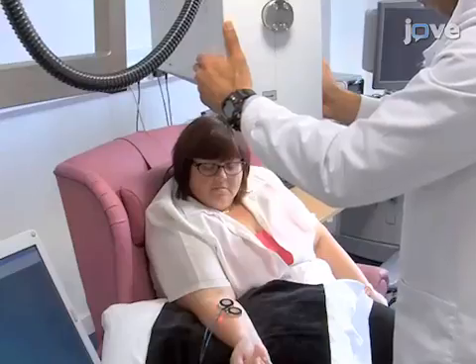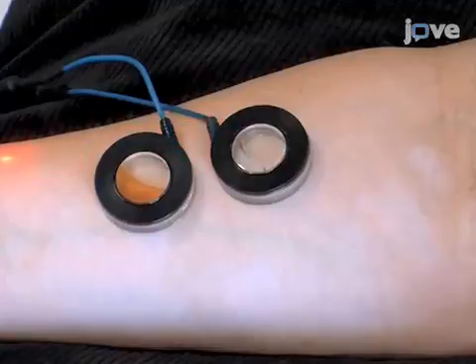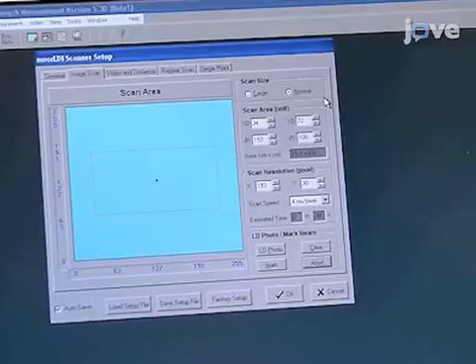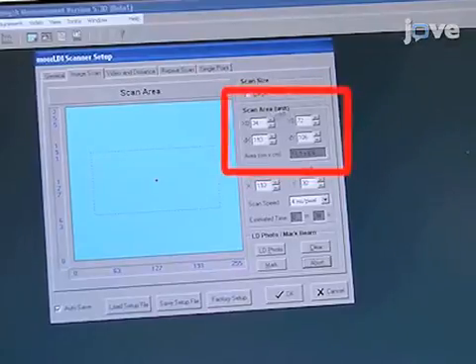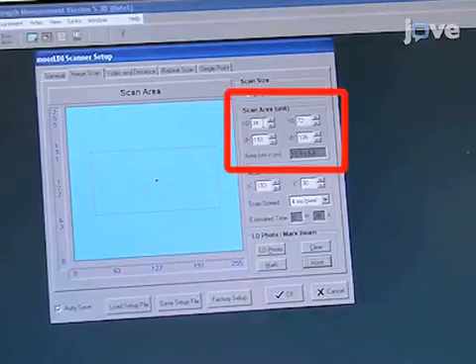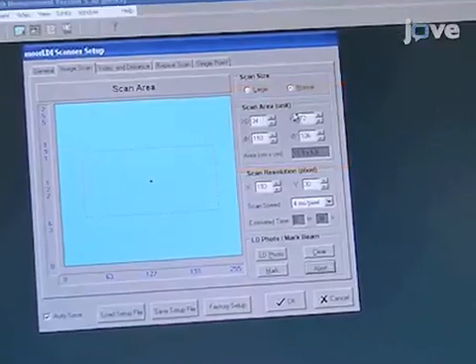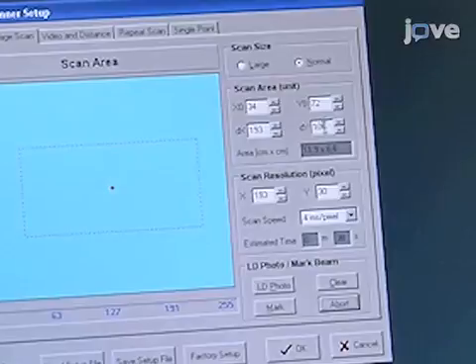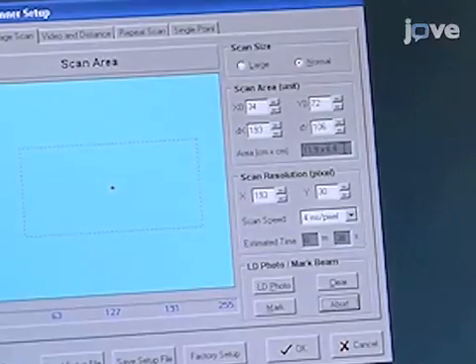Carefully position the scanner head so that it accurately scans the area of interest. If needed, manually change the region of interest by entering the size of the scanning area into the Scan Area section near the top of the window. Ensure that the region of interest includes the diameter of each of the iontophoresis chambers and is large enough to limit variability in skin blood flow.